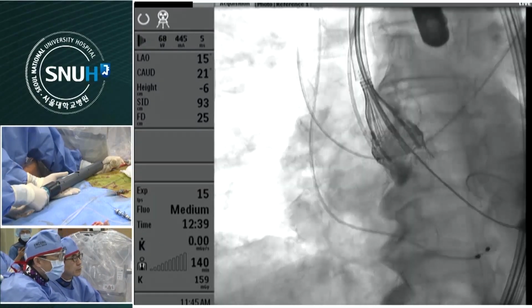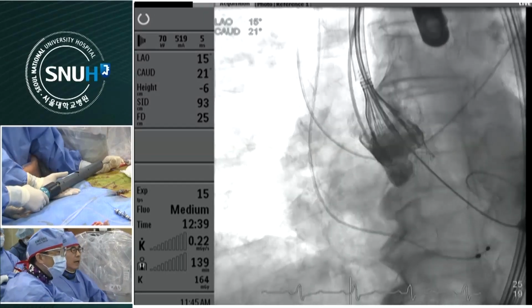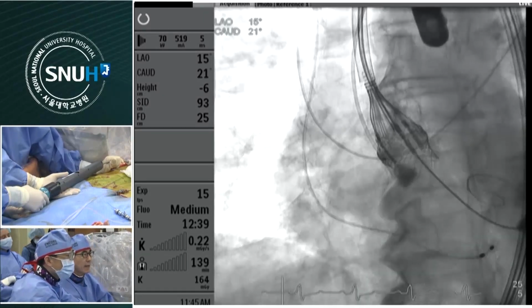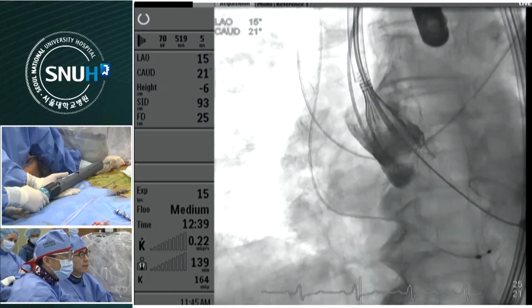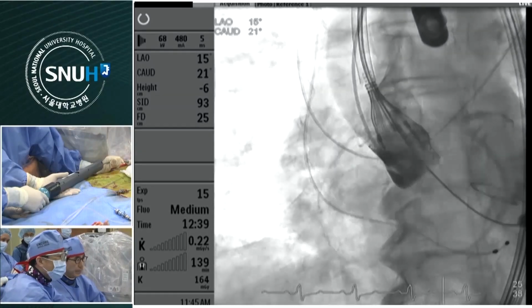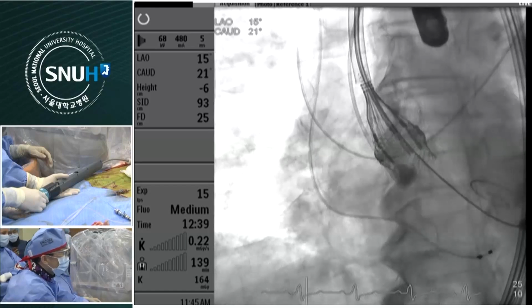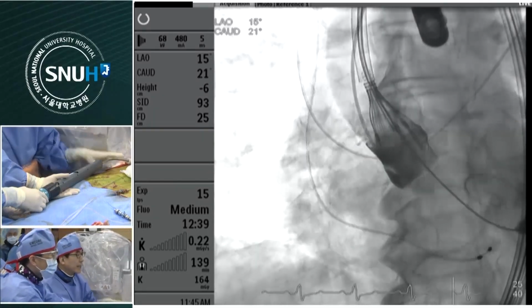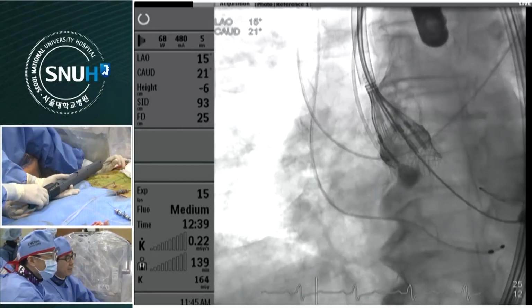Distal margin of the lotus valve. How about it? I think it is too high at this angle. Thus, I recapture the system to adjust the implantation depth. How many minutes are remaining? 1 minute 45 seconds. I can show you the recapture process for the next 1.5 minutes.